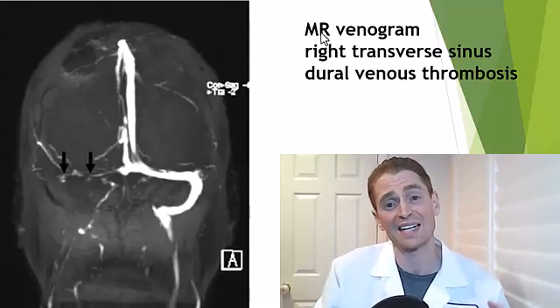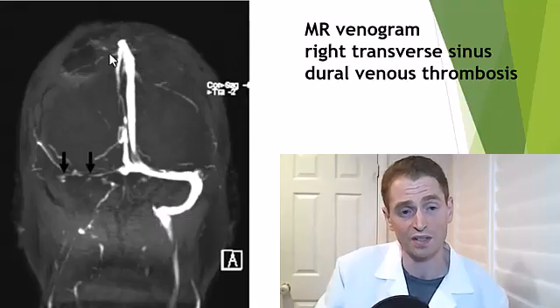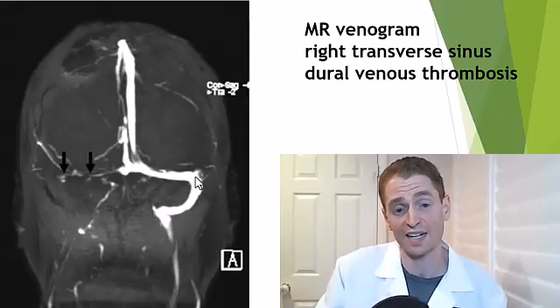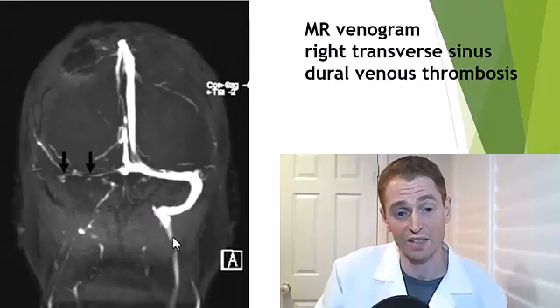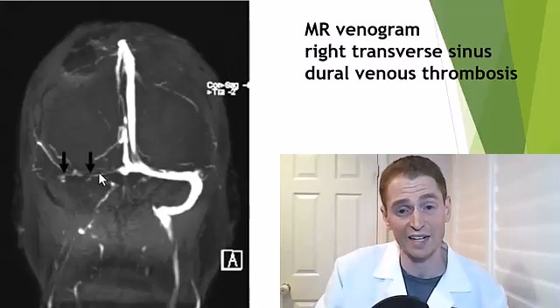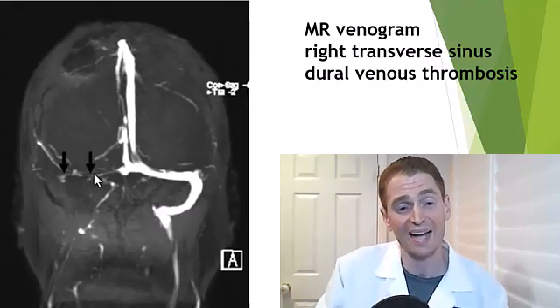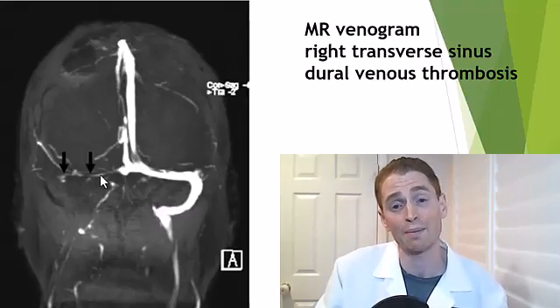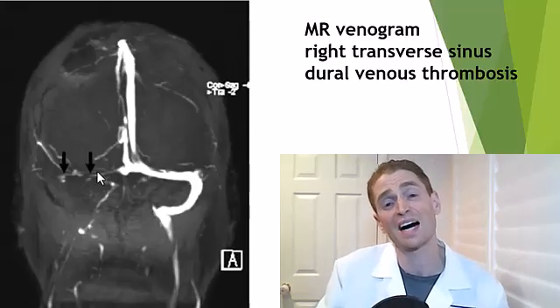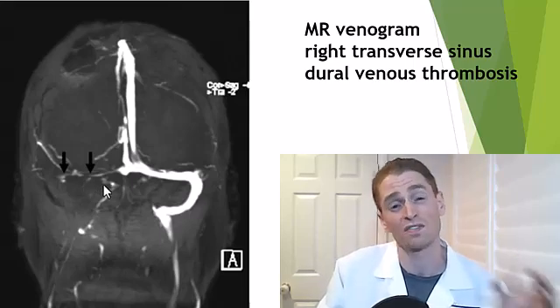This is an MR venogram showing a blockage in the right transverse sinus. Here is the superior sagittal sinus and the left transverse sinus, sigmoid sinus, going down into the jugular vein — but the system is completely blocked off on the right side due to a clot. This can cause headaches, strokes, and even brain hemorrhages, and is typically treated with blood-thinning medications such as heparin. However, be careful because the venous system is often highly asymmetrical, which could lead to false positives.